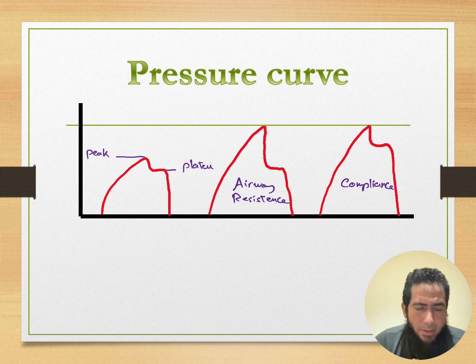Okay, so to explain this, we need to say that we have two things. If we are ventilating any patient, you got two things to worry about: CO2, okay, and oxygen.